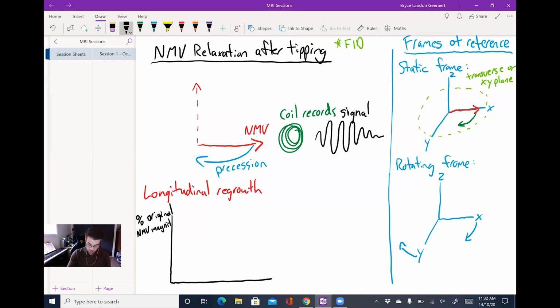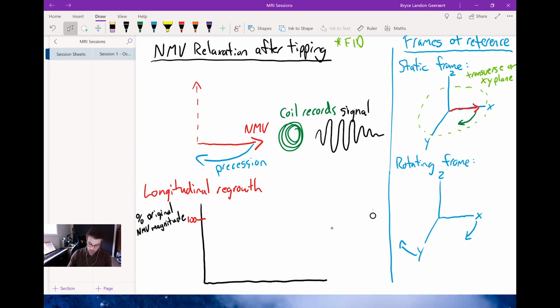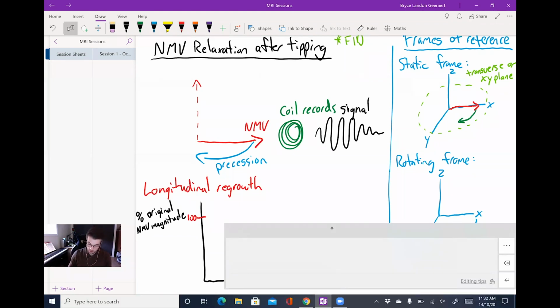Yeah, I'll write out magnitude. I'm going to give myself even more space because I wanted this to be really clear. So at rest, that NMV is going to be at 100%, right? Let's draw this in red. And let's say that on our y-axis, that's up here, 100%. And this axis down here, I'll scroll down a little bit if I can without opening the type menu.